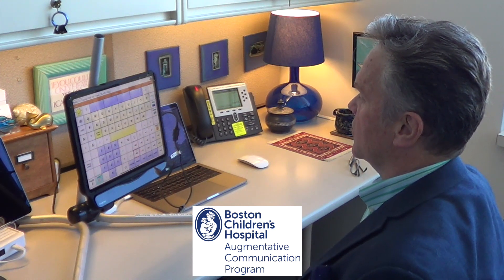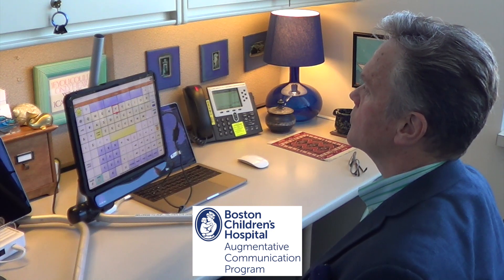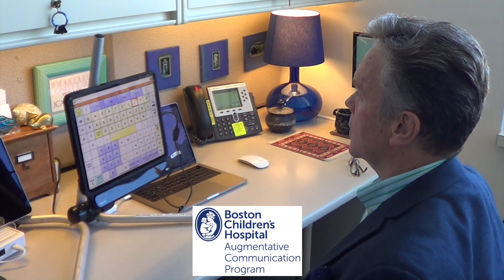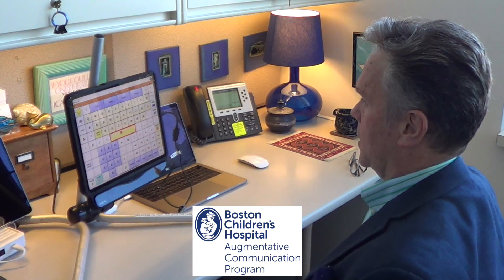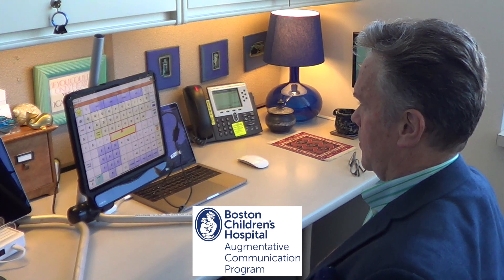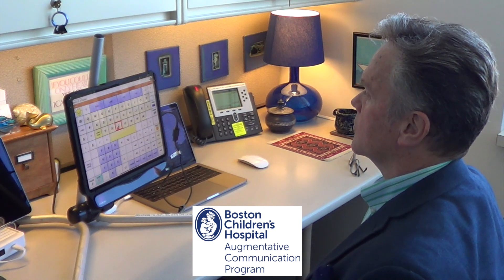I want to work. This. This is a better calibration.